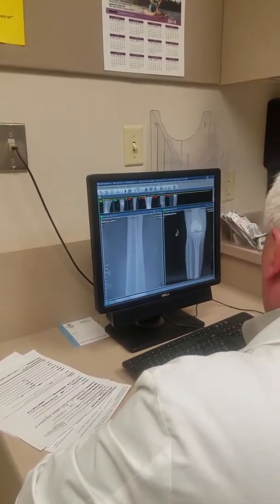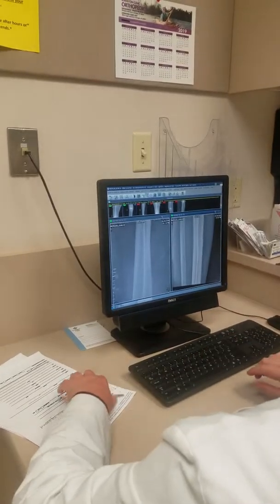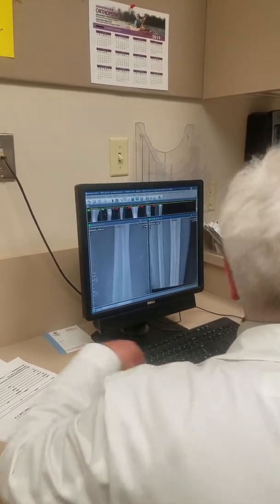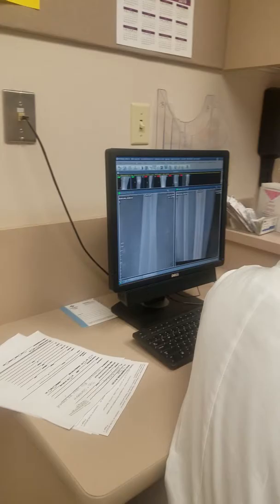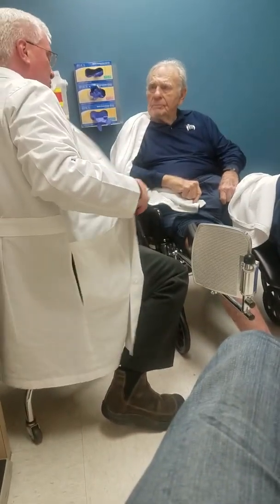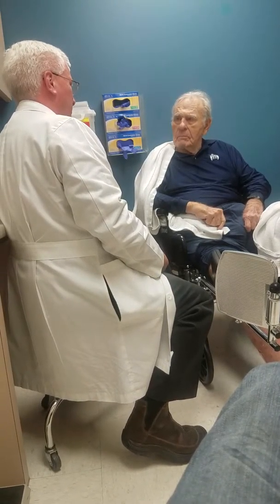It's also present down here too. There's that wire and there's that there. What we do is we take the wire and roll it like a tootsie roll of cement. The cement is very low quality because we diluted it heavily with antibiotic powder, which weakens the cement but holds the antibiotic in there so it leaches out slowly over time. Most of the antibiotics are probably gone by this point — it's been right at six weeks, so it takes about six to eight weeks to leach out.